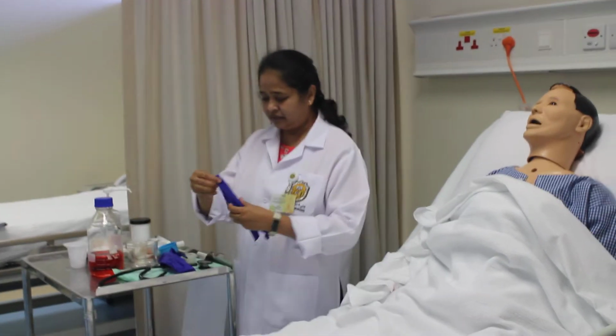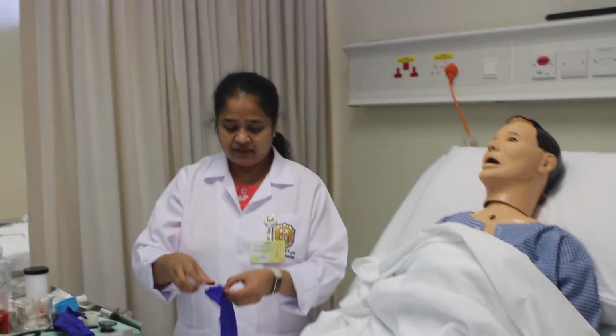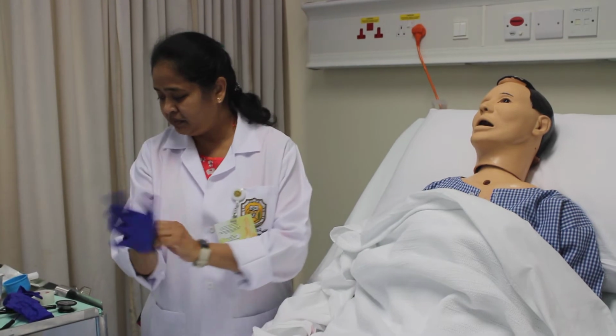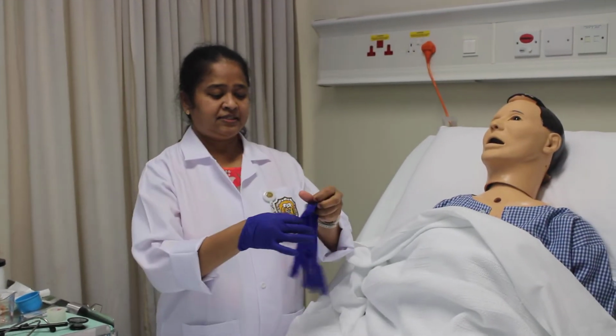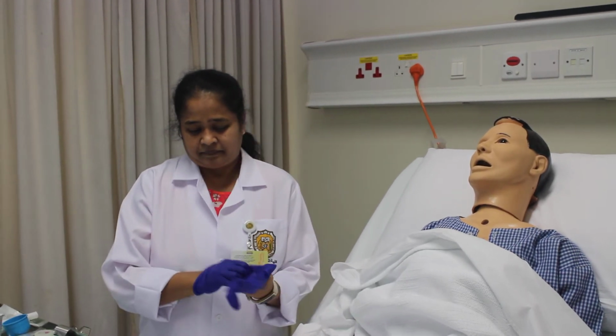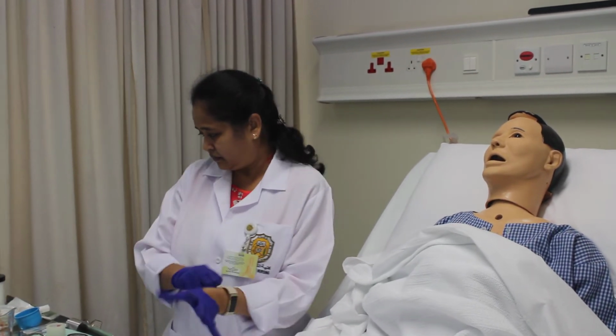Okay. Before we start the procedure, we have given all the instructions. We have positioned the patient. Now we are going to measure how much of the tube should be inserted inside my patient's stomach. So how do we determine that?